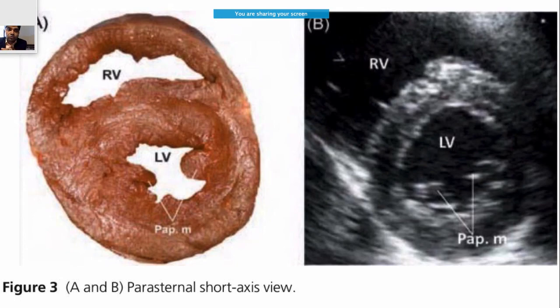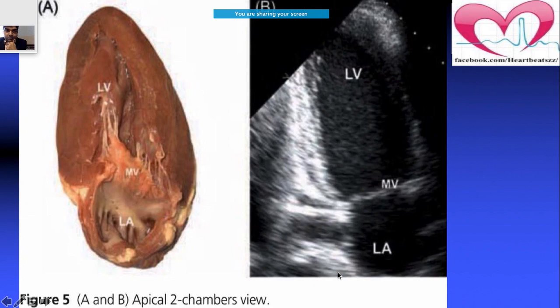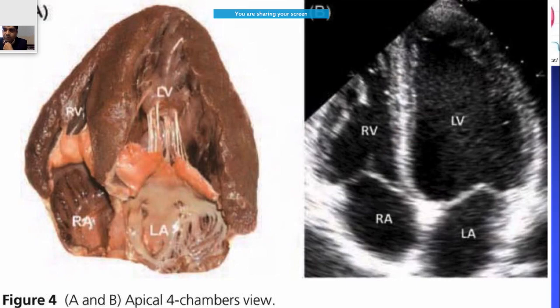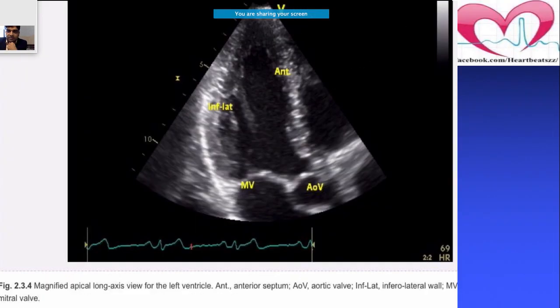You may recall from ECG sessions about papillary muscle VT — in the parasternal short axis view you can also identify the papillary muscles. In the apical two-chamber view, you see the left atrium, left ventricle, and mitral valve. In the apical four-chamber view: LA, LV, RA, RV. In the apical long axis view, you see the anterior and inferior walls, and tilting slightly reveals the inferolateral wall and aortic valve.